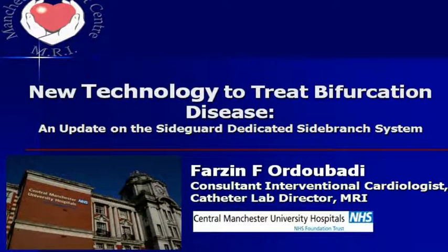What I'm going to do is to show you some live case examples of using SideGuard. And I think some of the questions that were asked, hopefully we'll be able to answer, because all the issues about whether you cross, whether you stent into, or whether you just treat the side branch, I've got examples of those that I'm going to show you now.